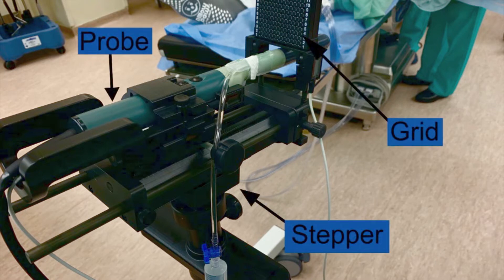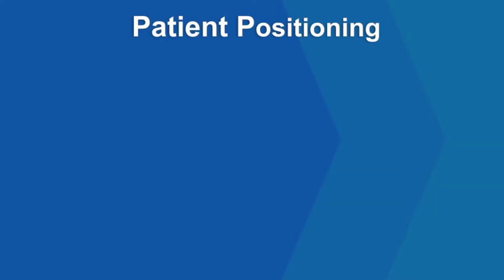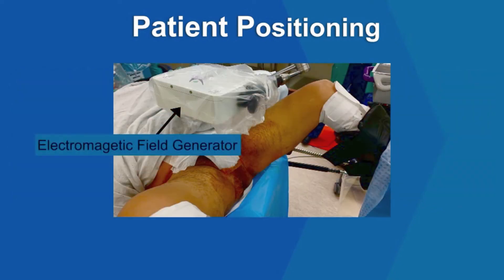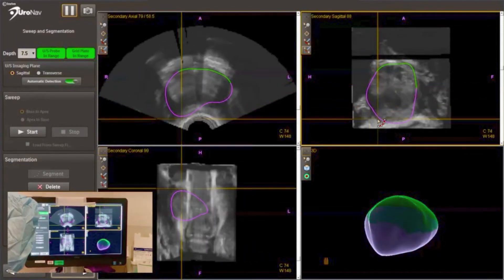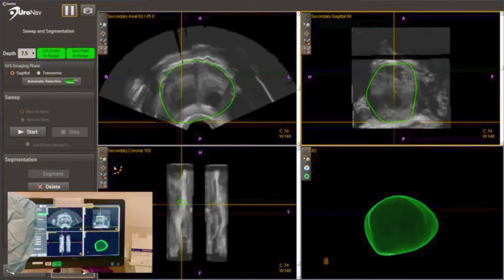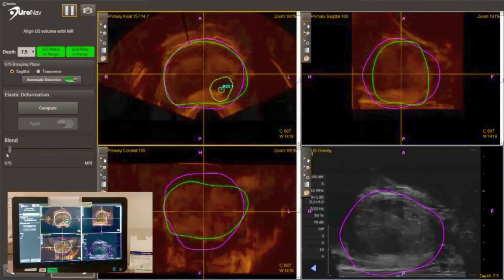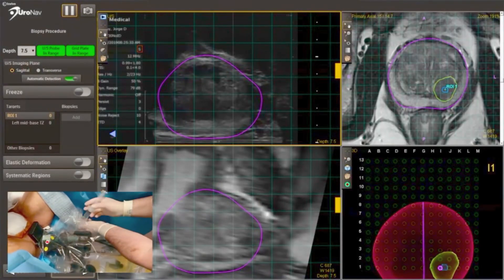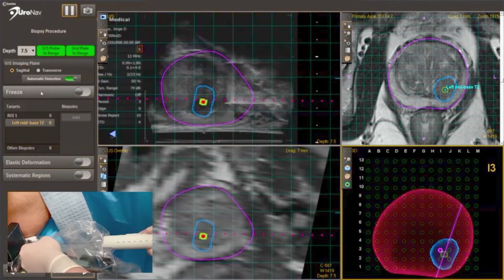Components of the biopsy module include the grid, the stepper, the probe, and endocavity balloon. The patient was positioned as shown, with the electromagnetic field generator just above him. Real-time ultrasound is loaded onto the URONAV platform and the prostate is outlined. The patient MRI is then aligned with the outlined prostate and the targeted lesion is delineated over the ultrasound. The endocavity balloon is then inflated to raise the prostate within the region of the biopsy grid.